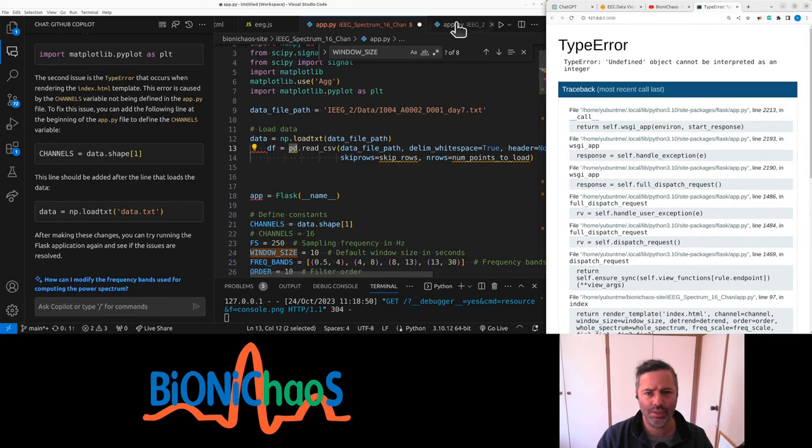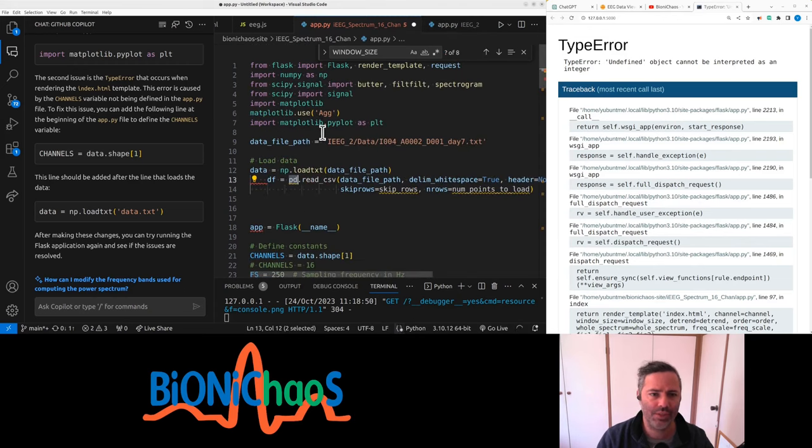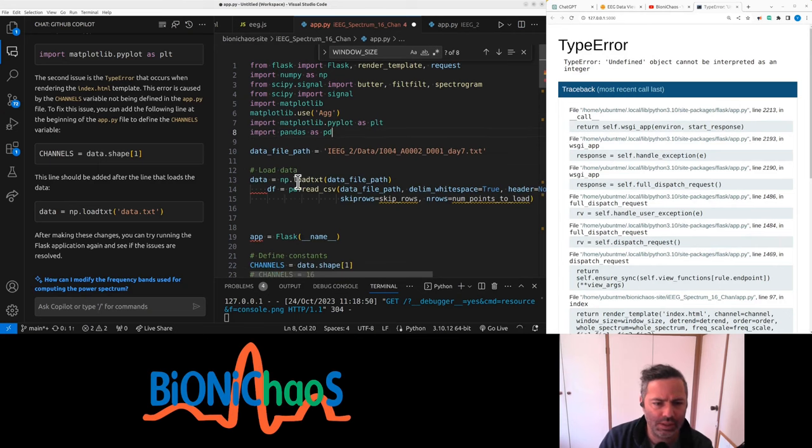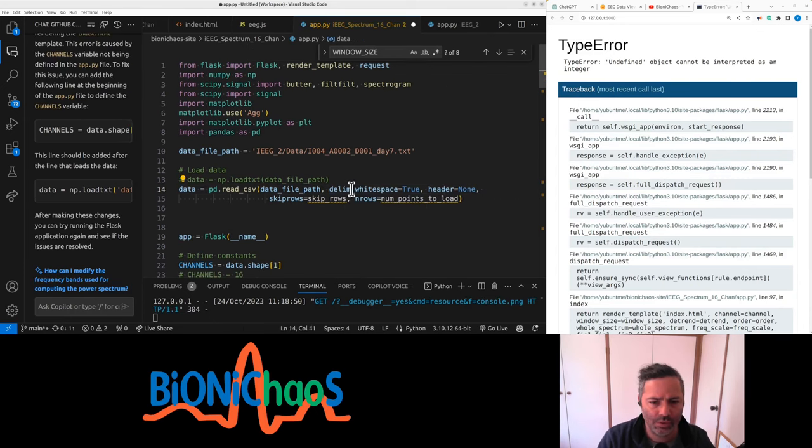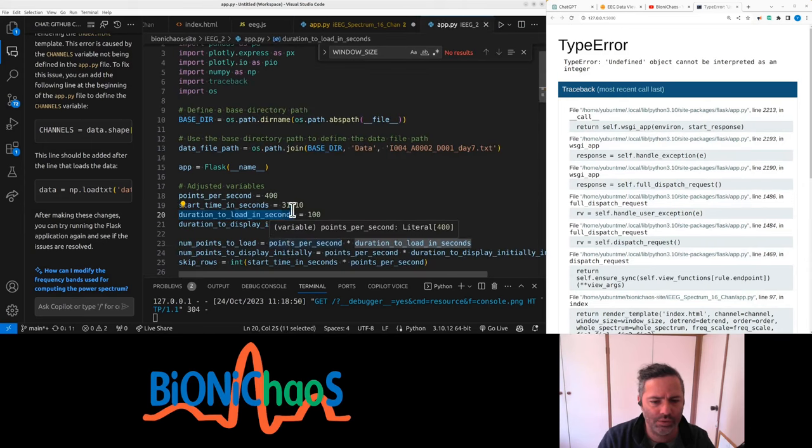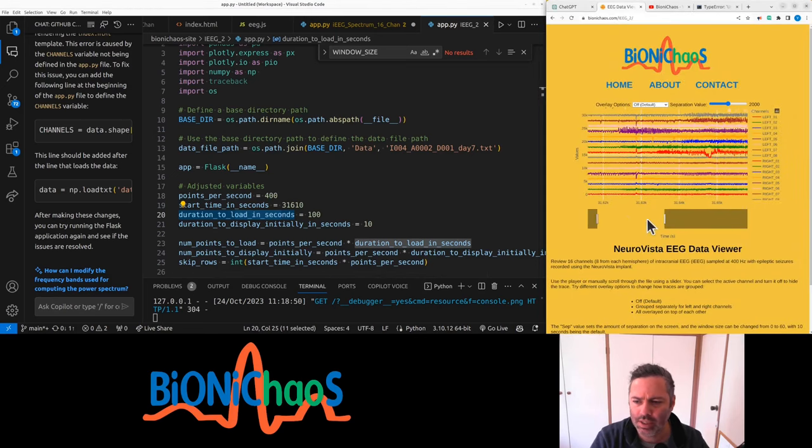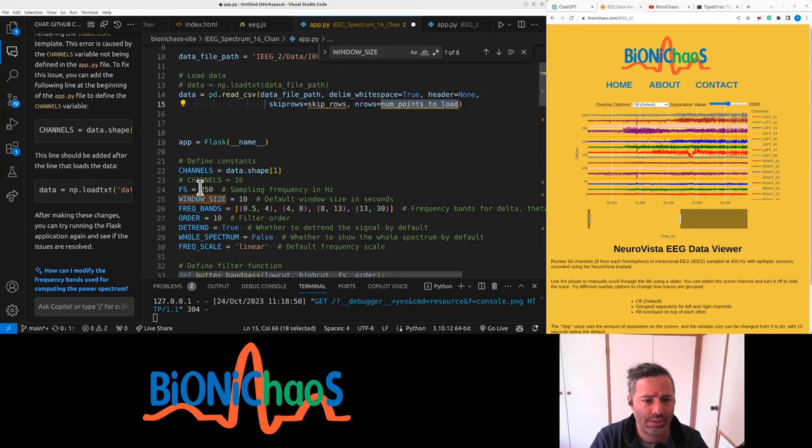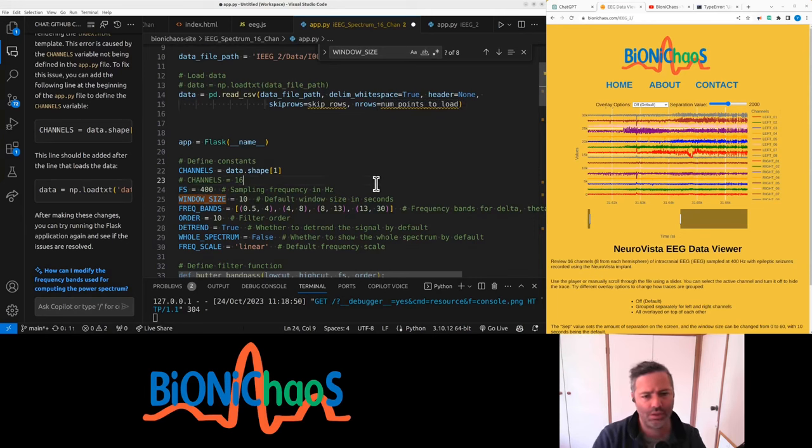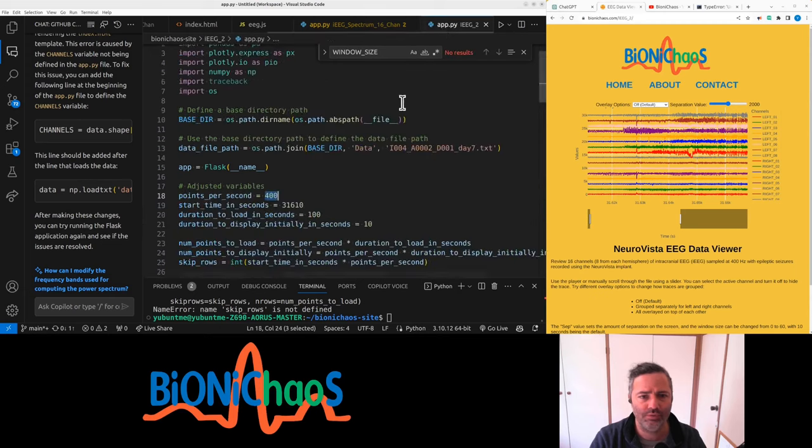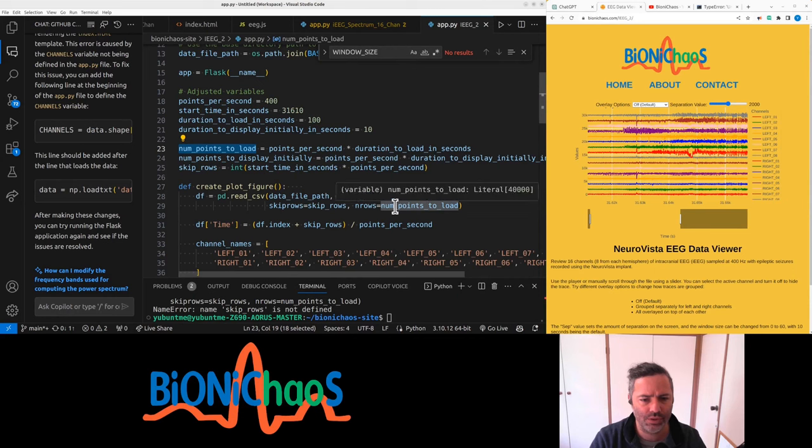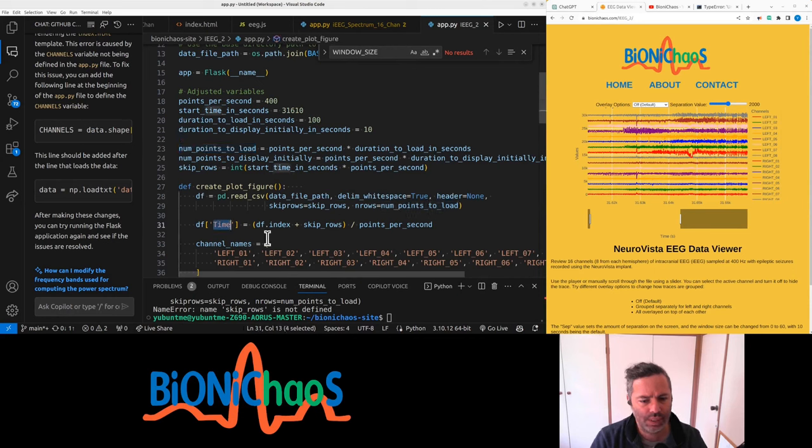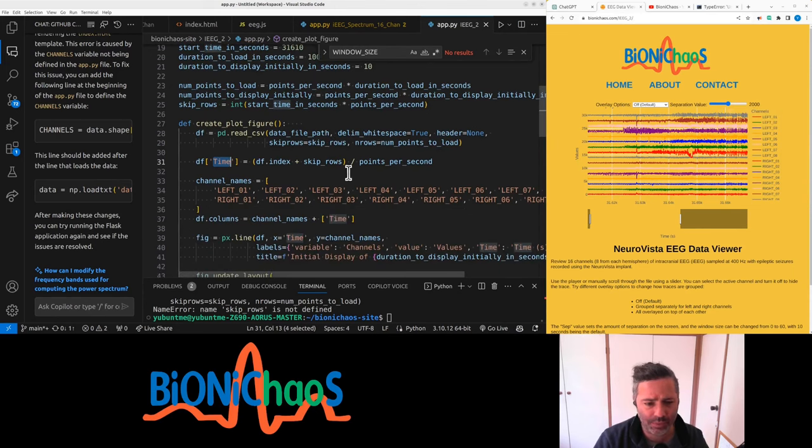Let's see what's pd - pd is pandas. So do the same thing because it just worked before. So we have pandas as pd. It's a very large file, so we don't want to read the whole file. Number of points to load, duration to load. Yeah, I think in this file we're loading a hundred seconds so then we can scroll through it. And I also remember that our sampling frequency is not 250, is definitely 400. That's just what the data set is. Skip rows is not defined - we actually need those. We use it over here, and we will have a y and x access to it.